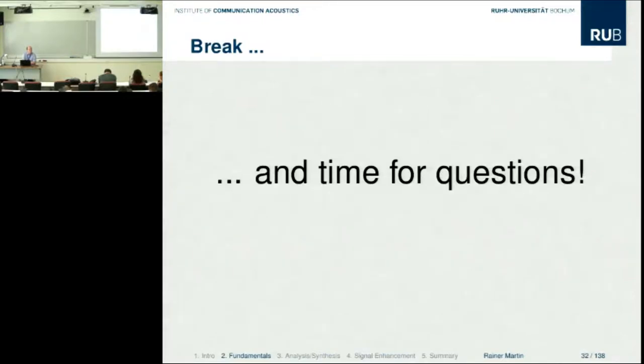The implanted systems have a longer life expectancy. So the implanted part stays there for quite some time. I'm not sure exactly how long, but 15, 20 years. But the processor, the outside part, is updated in between, and of course needs to be compatible with the implant.